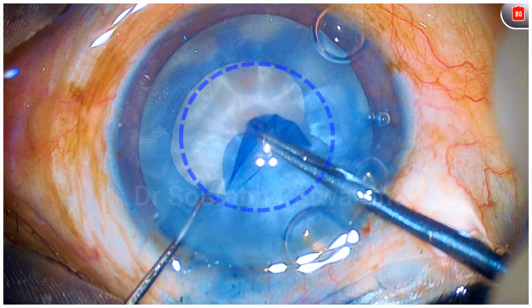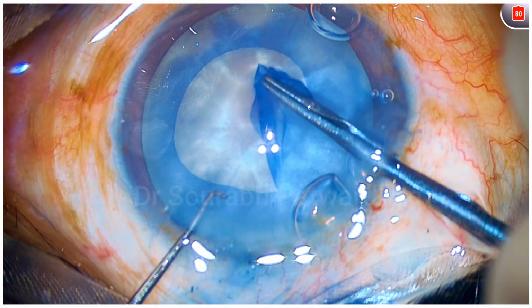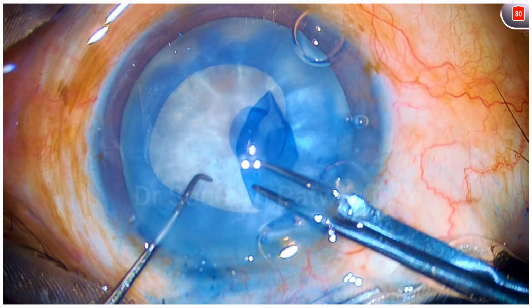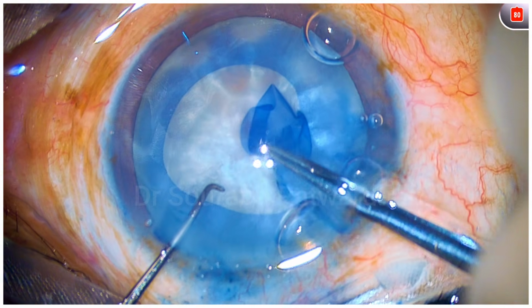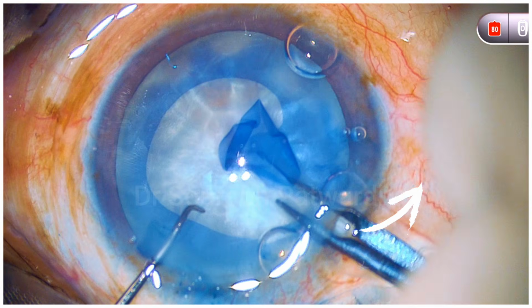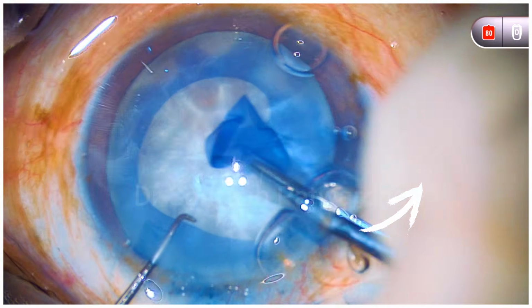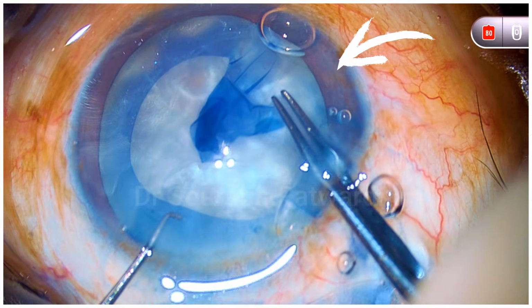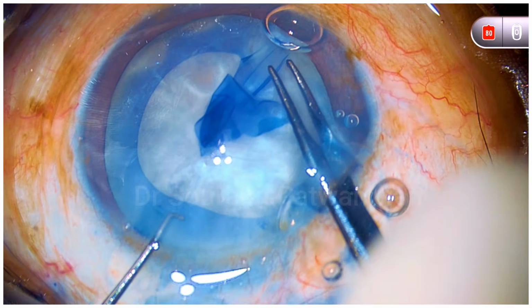Again, the surgeon tries to go with the same continuous force of ripping, and what you see is that it's going beyond that 5 mm circle. And also, if you look at the angle at which the capsulorhexis edge is now going, it appears that it tends to go outside, and that's exactly what happens here. And the surgeon is now trying to course correct by pulling it centrally. Still, it continues to go out, and finally, the quick pull is made in order to retrieve this capsulorhexis from the zonular area.